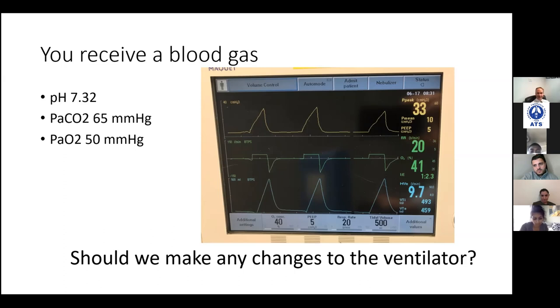I think I would like to blow off more CO2 by increasing his respiratory rate. Okay, but back up now. What was our diagnosis? Oh, yeah. That's true. This is an ARDS. So you are absolutely right. This is a respiratory acidosis situation, but that isn't our biggest problem. You buying that? Okay. It's certainly not our patient's biggest problem right now.